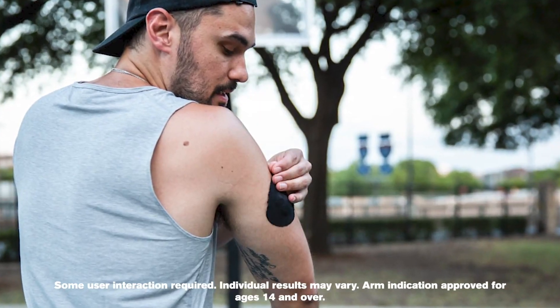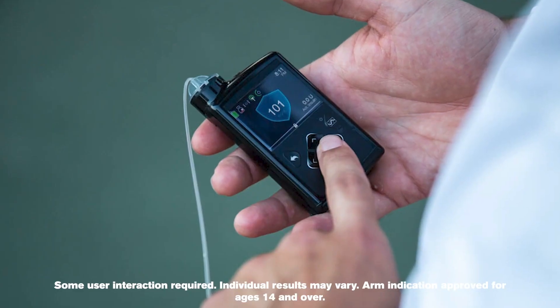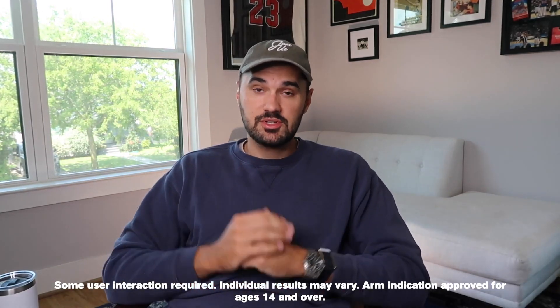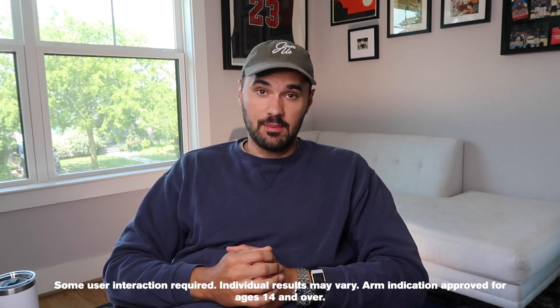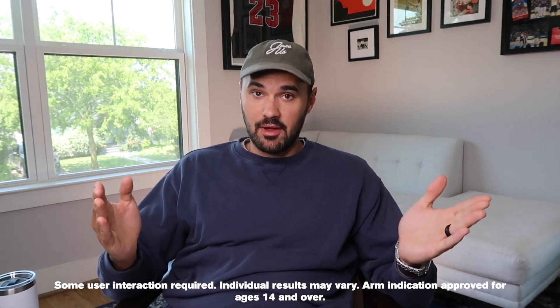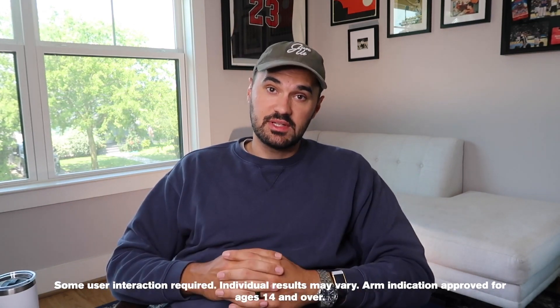SmartGuard Auto Mode relies on readings from the Guardian 3 sensor to determine how much insulin you need. It will determine every five minutes how much insulin you need, whether your blood sugar is high or low or right in range, and it will give you the appropriate amount of insulin. This is just for basal insulin or background insulin — you will still need to bolus for meals. When your sugar levels go up, it will deliver more insulin. When your sugar levels are down, it will deliver less insulin, and you can suspend delivery if you need.